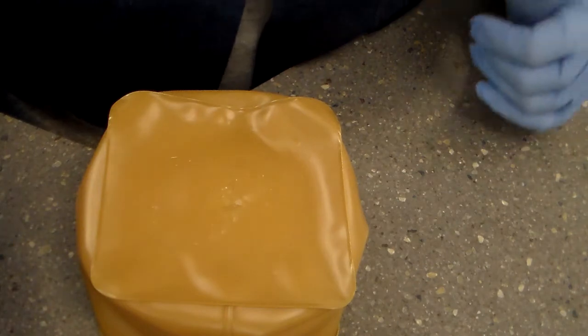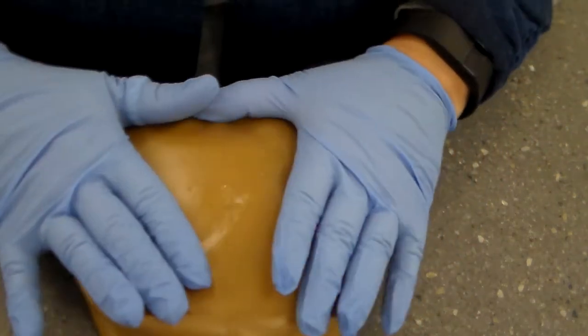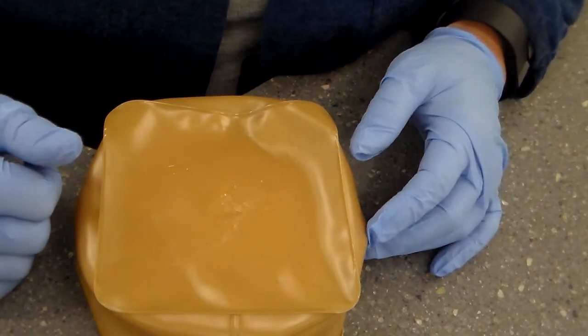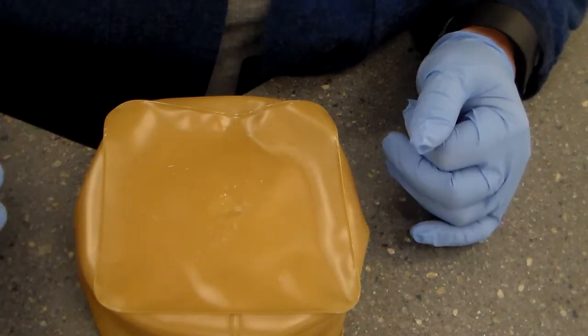Okay, so we've already been in the med room, we've done all our checks, we've come into the room, and now we're with our patient. You're going to perform wipes and explain the medications to the client. That's the last safety check. You're also going to tell them the purpose of the medication. You're going to select an injection site. Now remember, this is intramuscular.